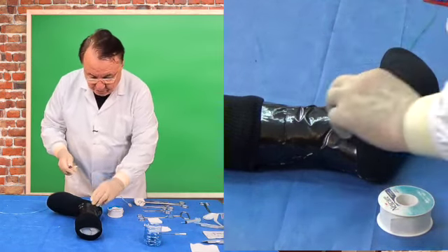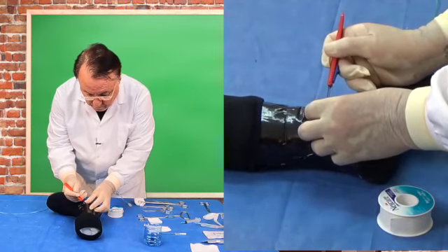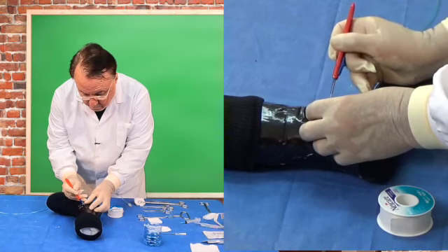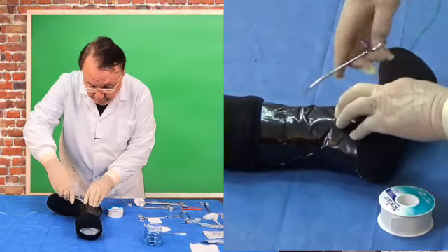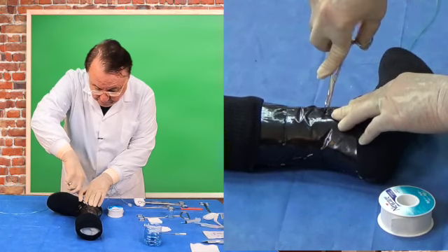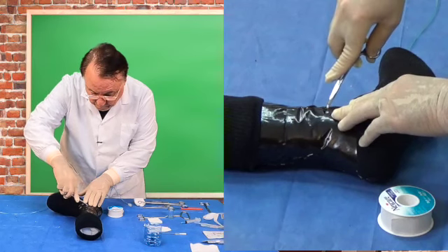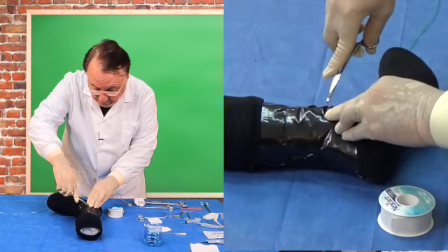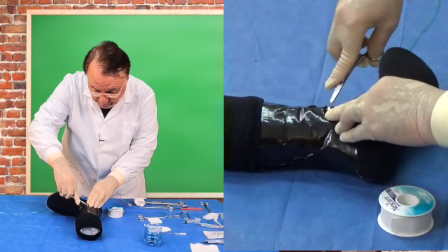Now we make an incision. We dissect into the skin, into the subcutaneous tissue, and we look for the vein. Sometimes it's easy, sometimes not so easy. And there I see the vein.